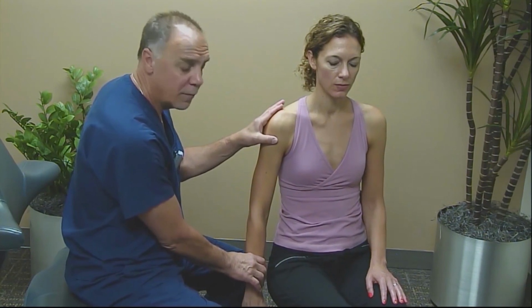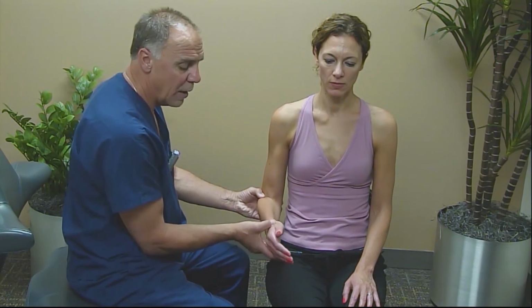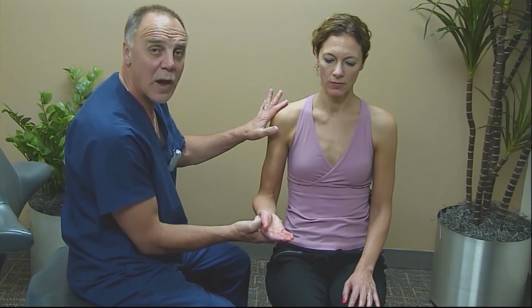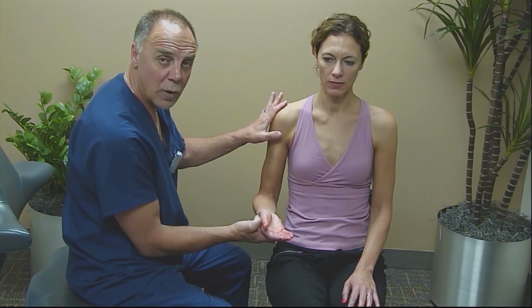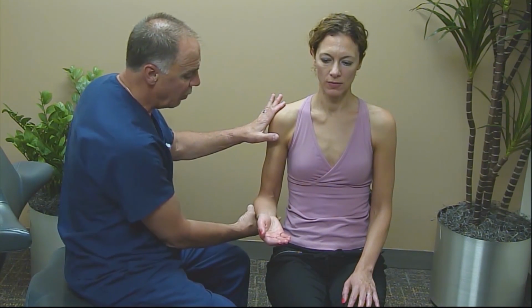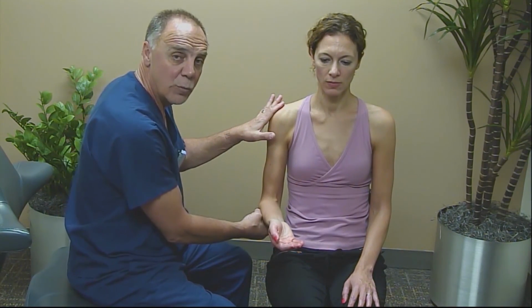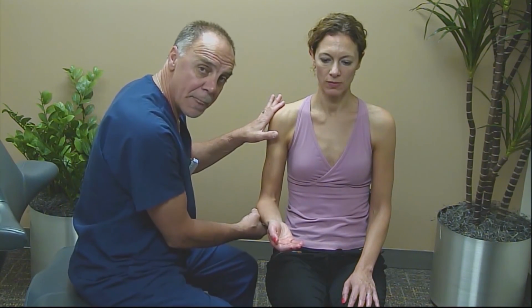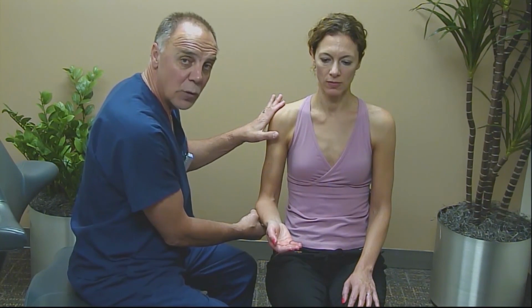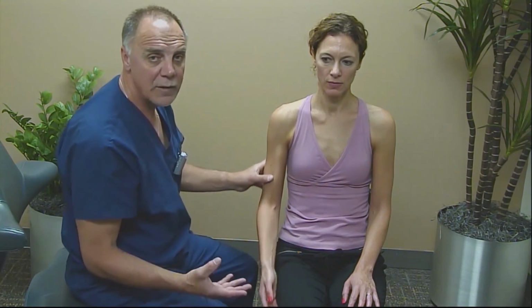A second maneuver that we would do is we have the arm bent 90 degrees, palm up, and then I'm going to place the transducer on top of the lateral edge of the acromion once more, looking for the supraspinatus tendon and the humeral head, and we just have them raise their arm, elevate their arm up, watching for the slide of the supraspinatus tendon and the subacromial subdeltoid bursa underneath the acromion. Those are the primary, or basic, dynamic maneuvers and positions of the body in evaluation of the shoulder.